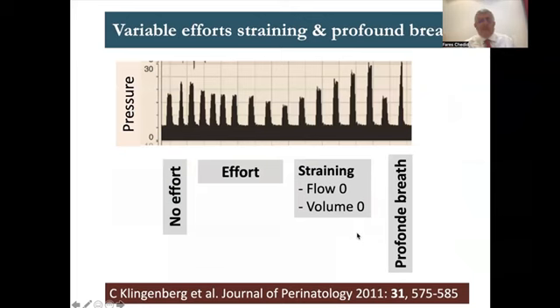Another picture of variable effort, straining, and so on. This is a patient who was doing initially no effort, and everything was done by the machine. And then he started helping the machine, and the PIP started going down, down, down, because he was helping the machine and getting more volume than we wanted. So no effort to effort. Then at some stage, he decided he will do what's called straining. He pushed like that and did not allow any air to come in.